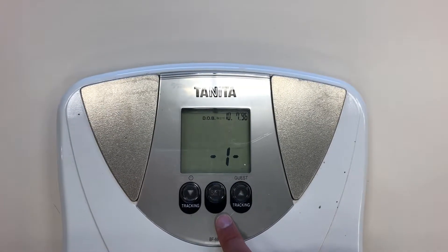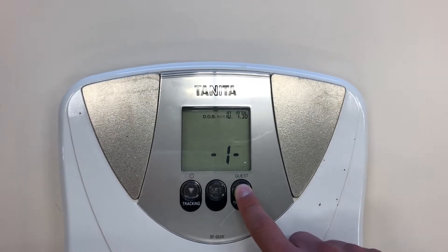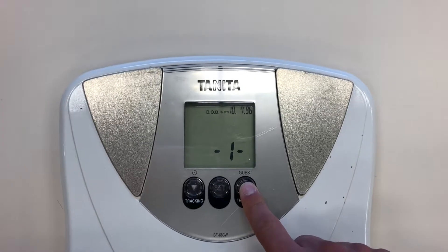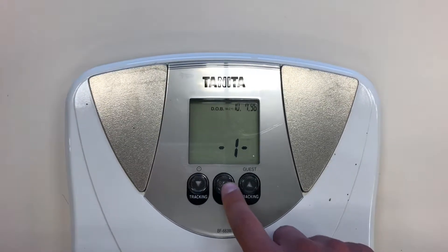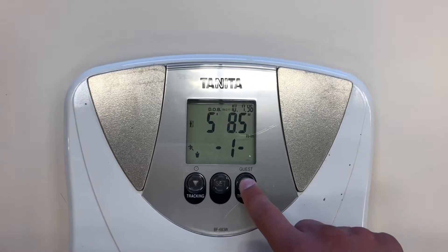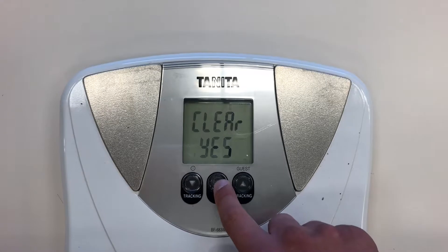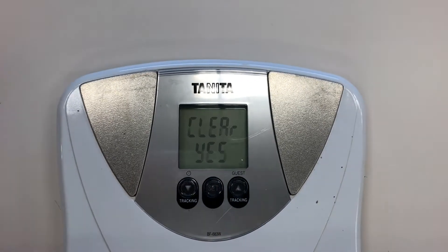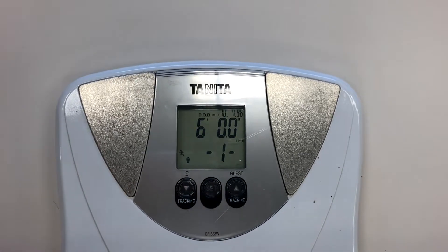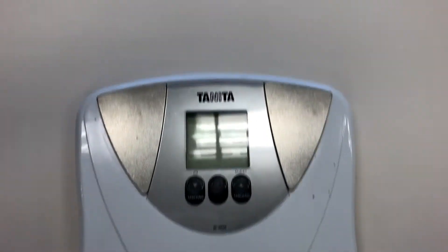Once you've done that, you have to choose between male and female. Using the toggle buttons to go up and down, it will show you female and male, and it will also show you active female and male. Choose the appropriate one, and then you have to enter in your height. Using the toggle buttons, enter how tall you are, and when it says 'clear yes,' the answer is actually yes, so press the set button and then you are set to go.